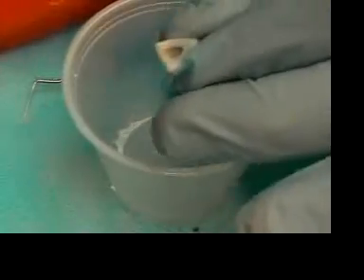Use the 40 file. And a quarter turn removed, biting into the plastic. You know, he's working through a pool of sodium hypochlorite.